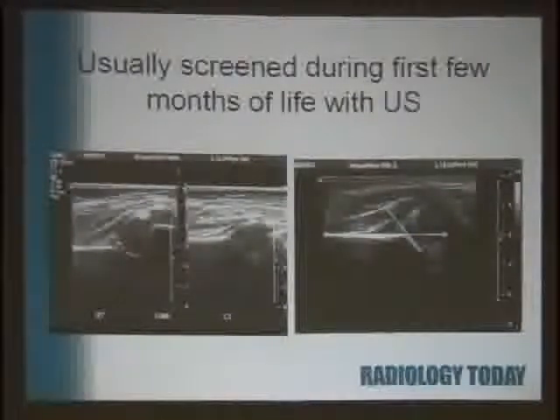This femoral head is way out laterally, and when we pushed on it, it was dislocating up, and the acetabulum, as you can see, instead of being this nice cup, is really shallow. And when I report the alpha angles, that's this angle. It should be greater than 60 degrees, which, you can see if this is 60 degrees, then that's nice and mature.